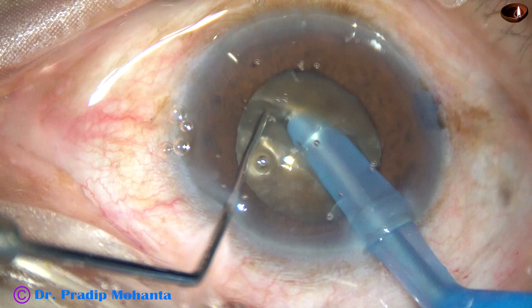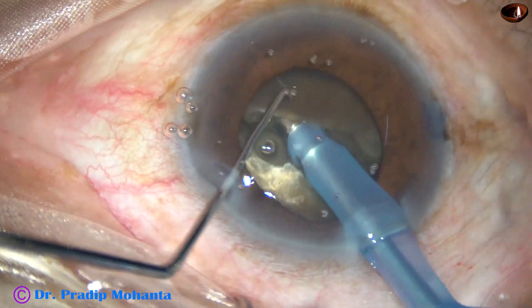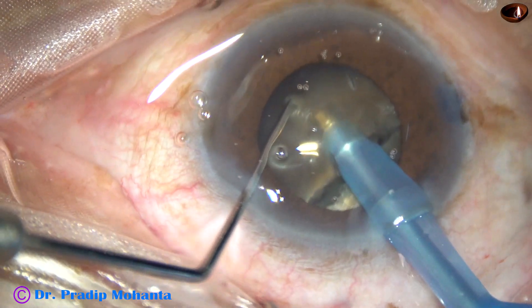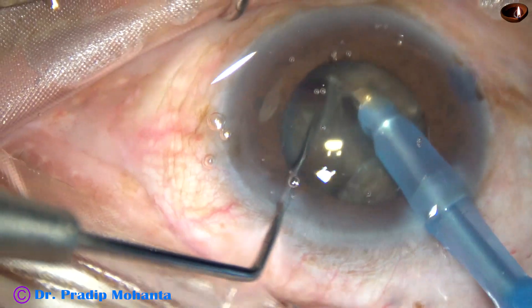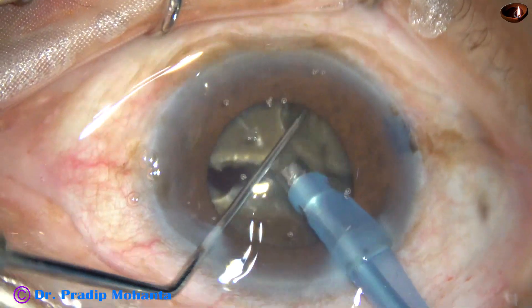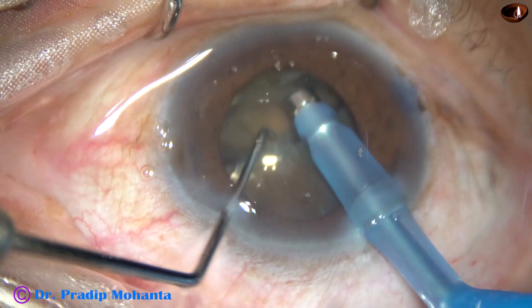Hold the heminuclei inferiorly and, along the initial crack, divide the two heminuclei completely. This is one heminucleus — trying to divide it into two fragments. There is a crack in the periphery, but at the center the two fragments are joined to each other by leathery fibres.